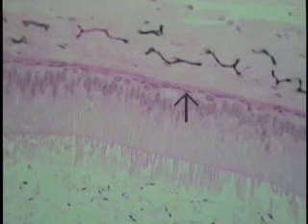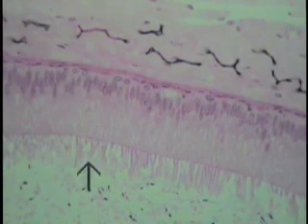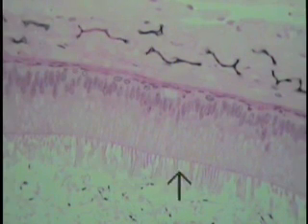It sort of has a false indication of stratification, so this is a pseudostratified columnar epithelium as well, though it appears a little bit differently. And we'll see later on that most of the male excurrent ductal system is lined by this type of pseudostratified columnar epithelium. Another feature that's illustrated here is a rather sophisticated form of microvillus.